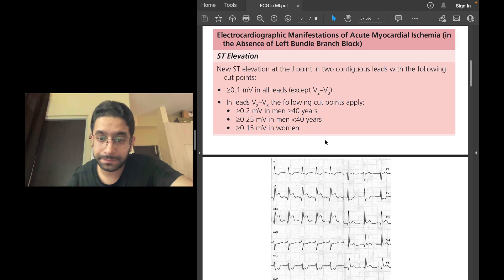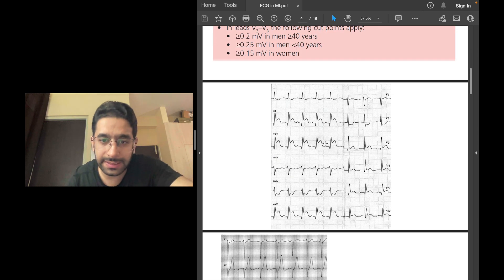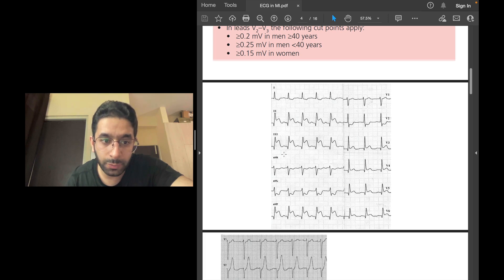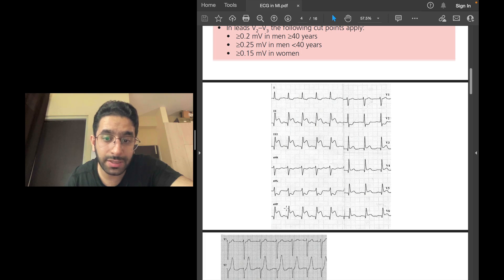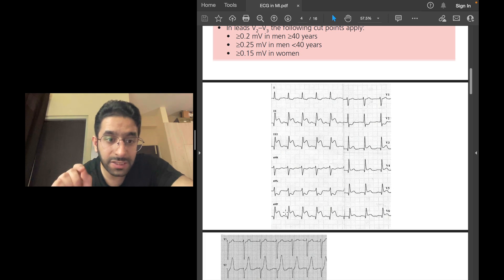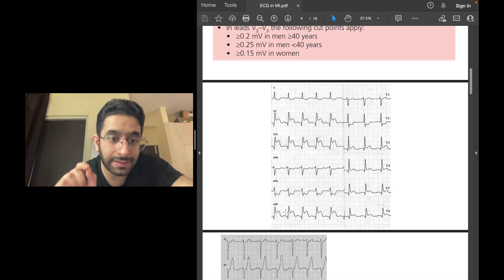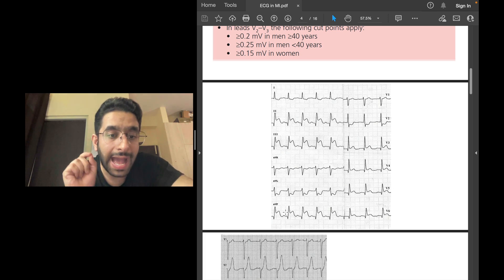In leads V2 and V3, the cutoffs are: 0.2 millivolts in men over 40 years, 0.25 millivolts in men under 40 years, and 0.15 millivolts in women. These specific values may be asked in the INICET exam. In this ECG, ST segment elevation is more than 0.1 millivolts and involves more than two contiguous leads — leads 2, 3, and AVF — consistent with ST elevation myocardial infarction.